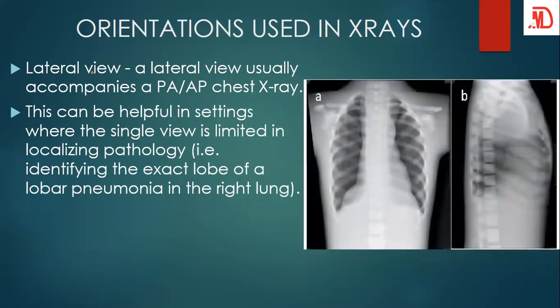So this is our diagram to tell us. For now, we'll go into the difference between the AP and the PA, and how to know whether this is an AP or a PA view. We'll go through it, so don't be in haste. But basically, the idea why I brought the picture is to show you the lateral aspect. This is the lateral aspect. You can even see how nicely the vertebrae are. Look at it, the vertebra is looking so beautiful.